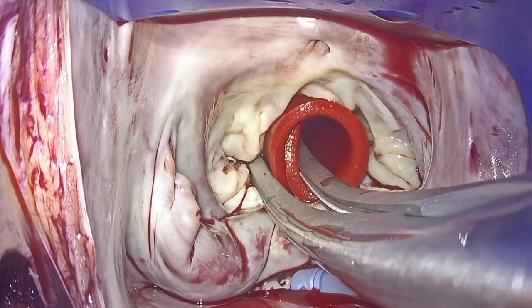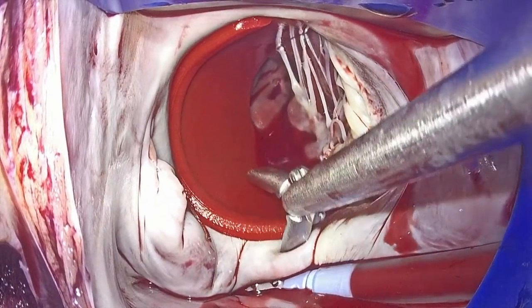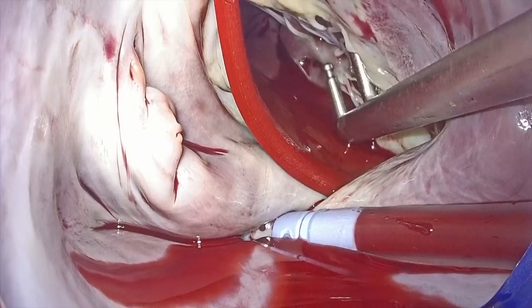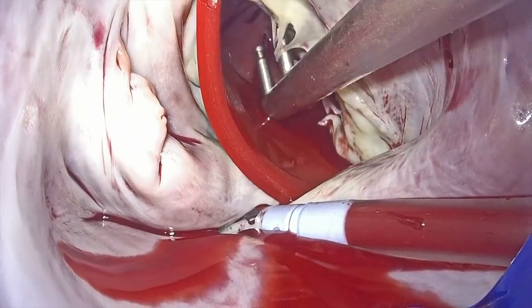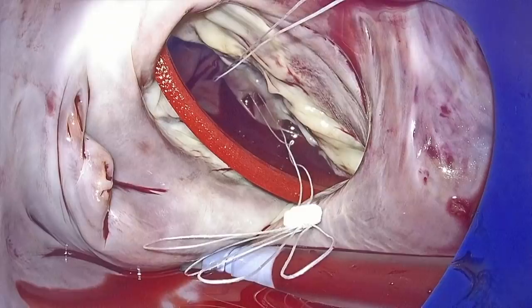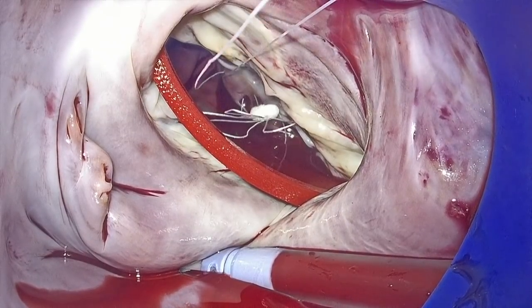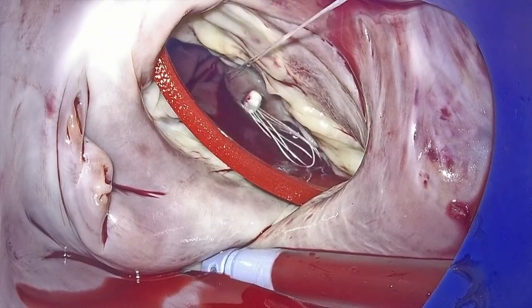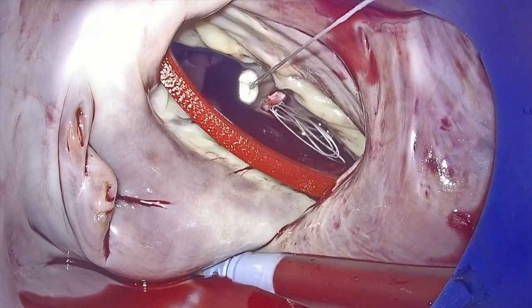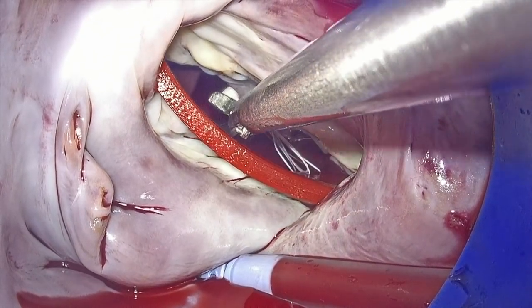A leaflet opening device was positioned inside the left ventricle in order to assist us to work in the subvalvular apparatus. The length of the chordae for the posterior leaflet was calculated as 18 mm, and therefore a preformed 4-paired loop was anchored in the corresponding head of the posteromedial papillary muscle.